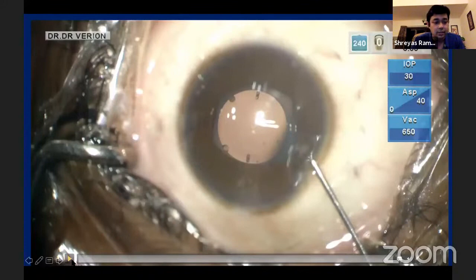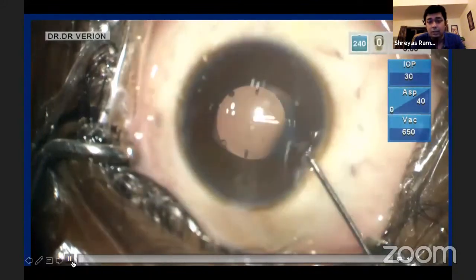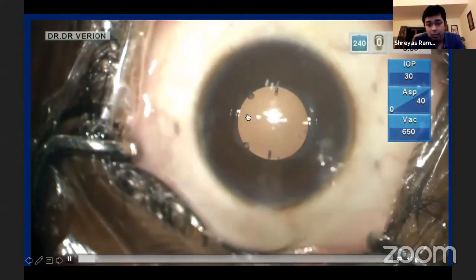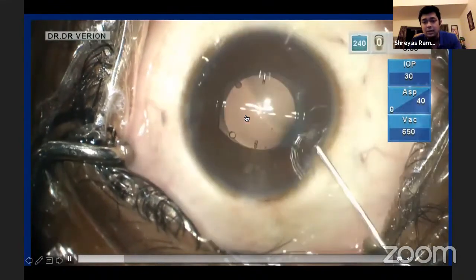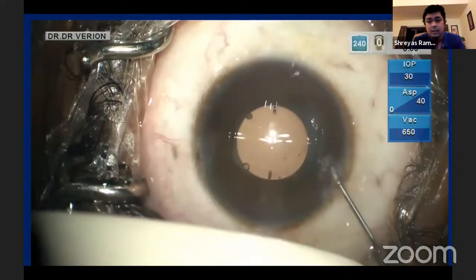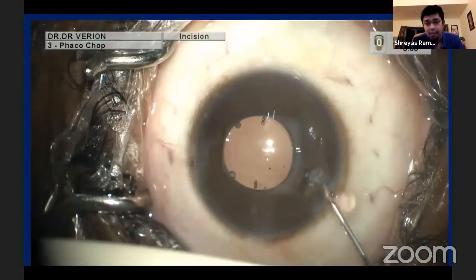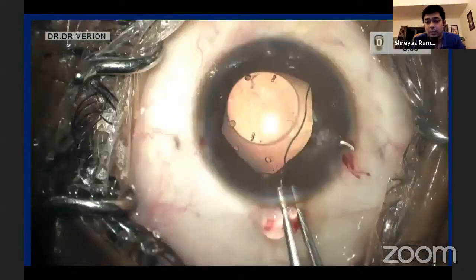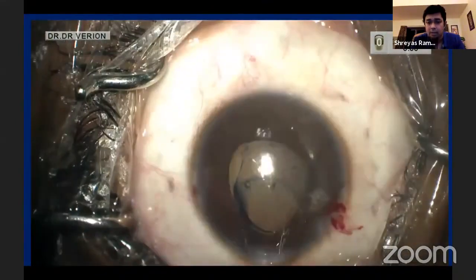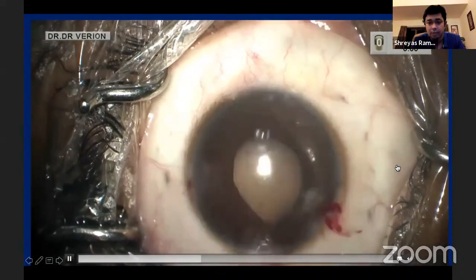In certain extreme situations, you can have a high vault, where in this particular situation, despite repeated attempts, the optic was tending to capture, was raising above the pupil. This is not very common, but it can happen in odd situations. And in these cases, you'll do well to explant it and put in a smaller sized phakic IOL.